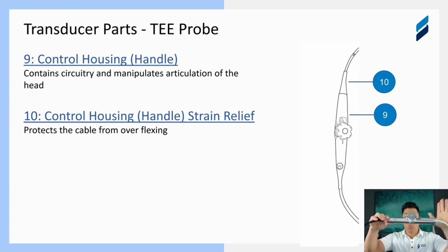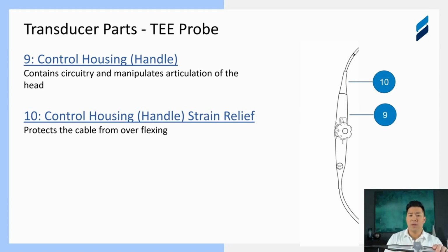If you're going to wipe it down, but we've seen this actually get dunked in water and sit there, and water will infiltrate it. There's some O-rings in here to protect from some light moisture getting inside here, but it's not meant to be underwater for any period of time. And so we see a lot of corrosion that occurs in here, where it might slip into a sink, and then things in here start to corrode.